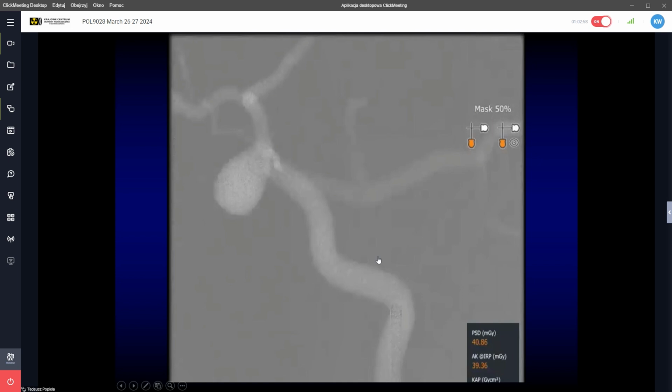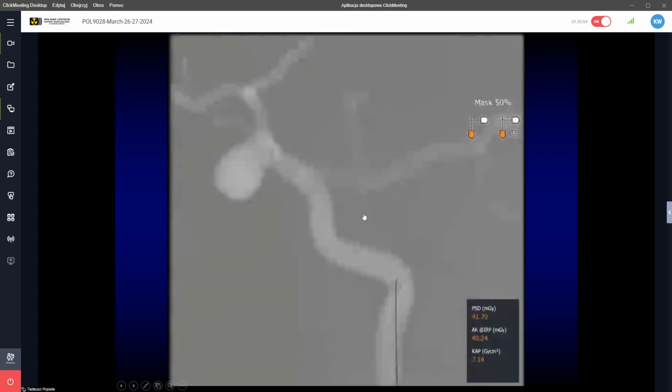And in seconds, it will become transparent, as in this case, and we are able, then, there is one condition: the patient cannot move. So this is why we usually perform it during general anesthesia. And then we have two images, the real one, using the fluoroscopy, where we can observe where we are with the catheter and with the guide wire, and we have this superimposed roadmap. So we know exactly where we are in terms of anatomy and which part of the vessel.